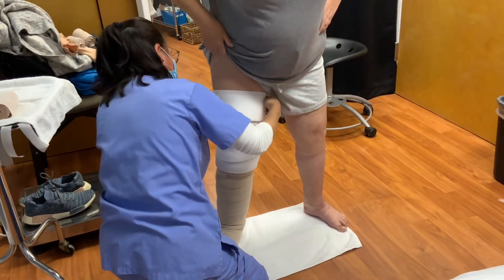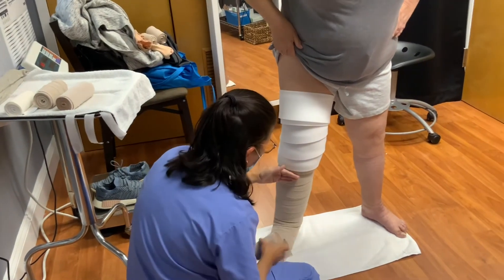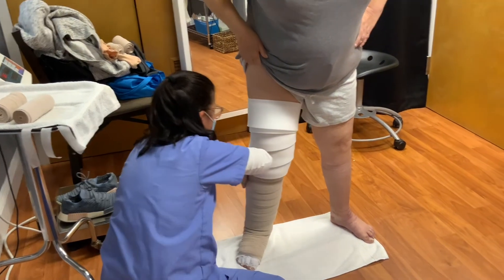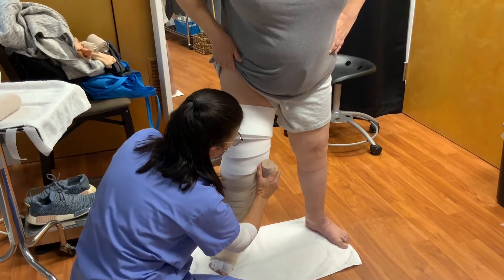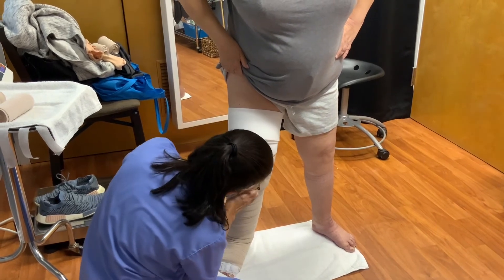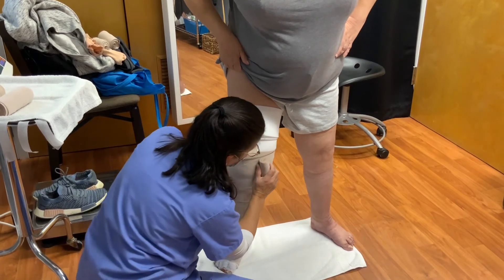You can tuck the corners in. Now we're going to start below where we finished off with the previous band — you don't want to start above that. You want to start right below and anchor it below the knee. We're going to come across above the knee. I want you to slightly bend your knee — I don't want the knee fully straight when we're doing this. We come above it and then drop it back down to cover the knee, giving it a little cross shape here because it's the angle of a joint that needs to move.